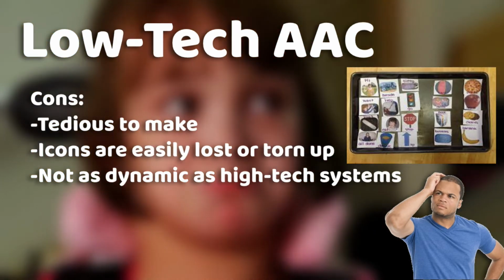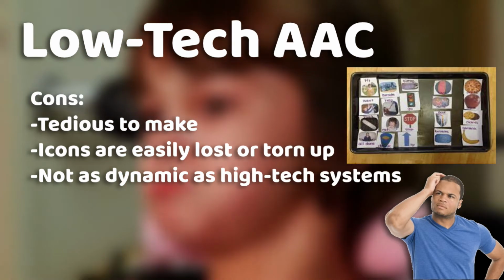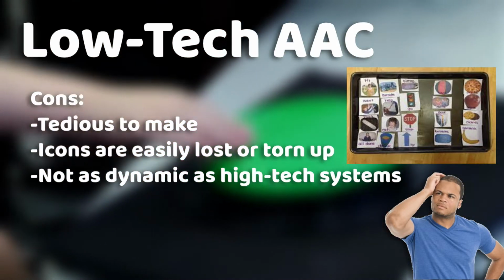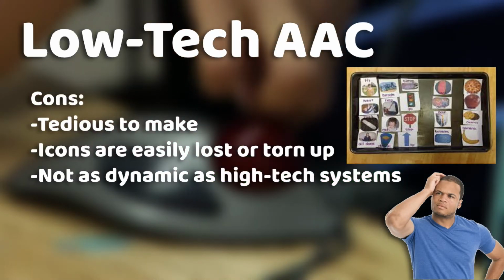After the low-tech setup is made, the icons can be lost easily or even torn up and thrown away. And they're not as dynamic as high-tech systems, in that if you want more vocabulary, now you're back to getting more pictures and preparing a whole new setup.